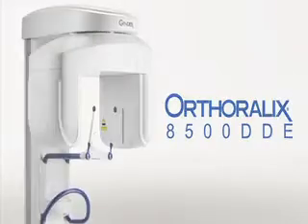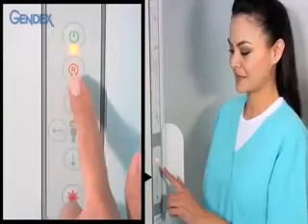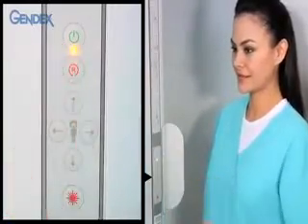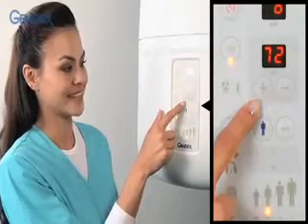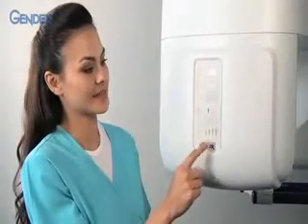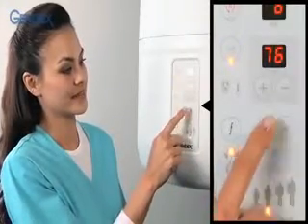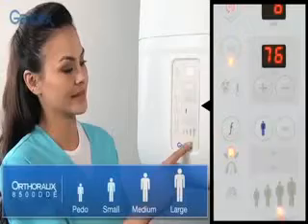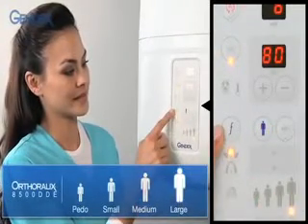To begin, verify that the power switch is on. Verify that the gantry is in the start position by using the reset button either on the column or on the gantry, the rotating imaging part of the system. Next, choose manual exposure settings or choose body type by pressing the patient size selection button until the desired body type is highlighted: pedo or small, medium, and large adult.